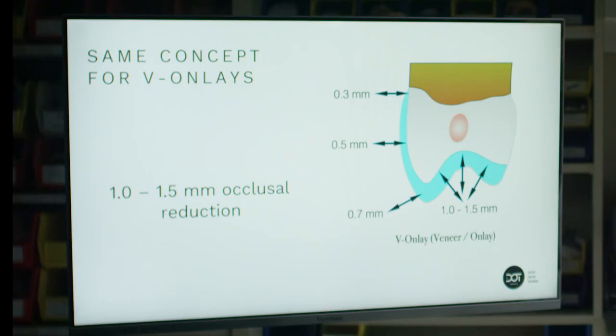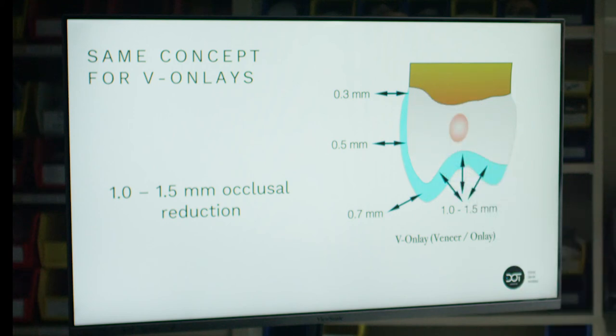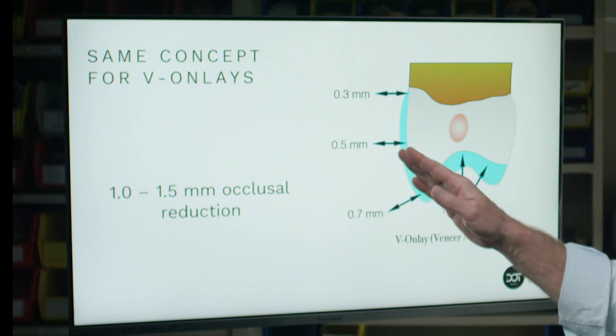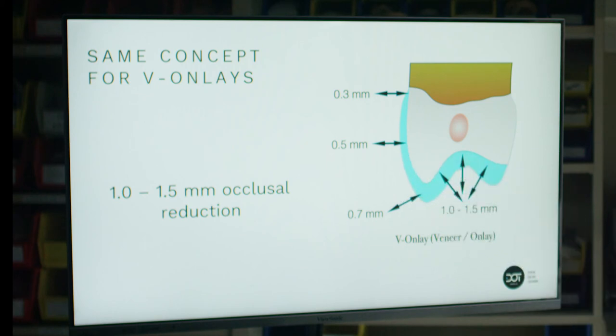If I'm going to be doing a vonlay or veneer onlay, the requirements are the same: about 0.3 millimeters for the cervical, 0.5 millimeters for the midfacial, and again about 0.7 to 0.8 millimeters to create the transition zone as we go onto the occlusal surface.